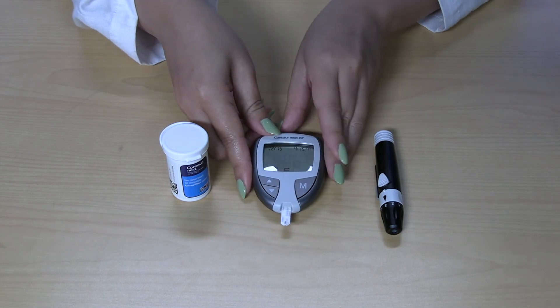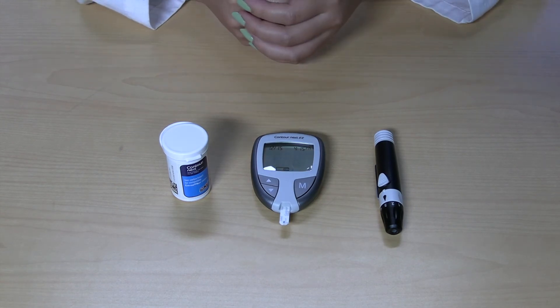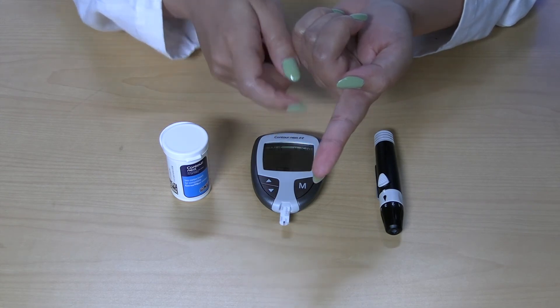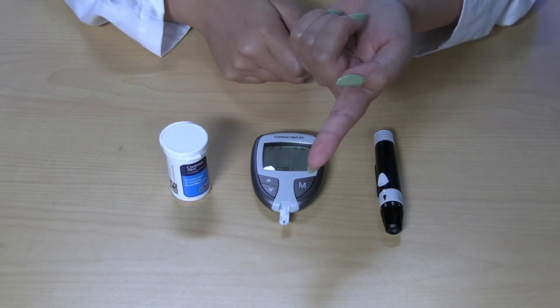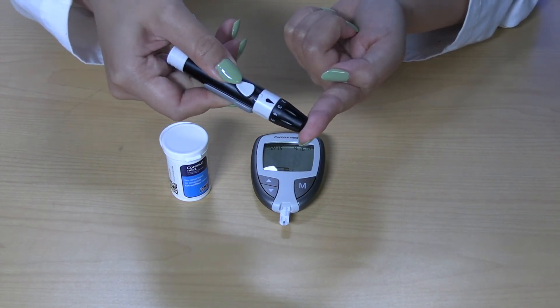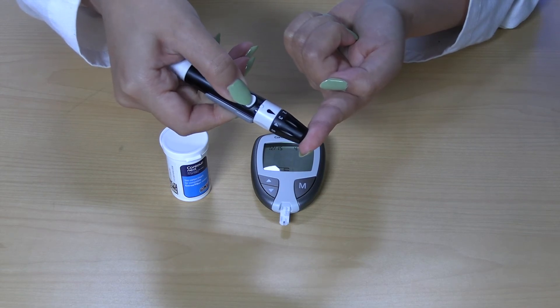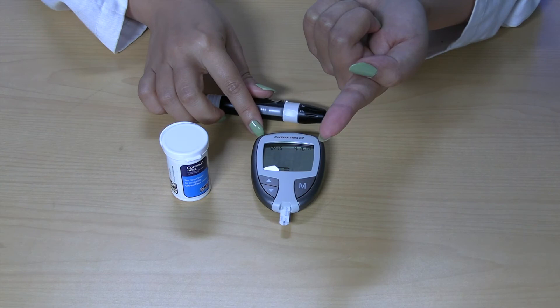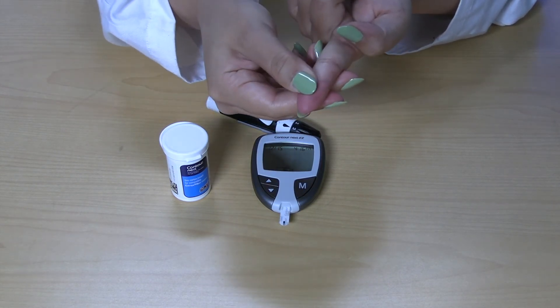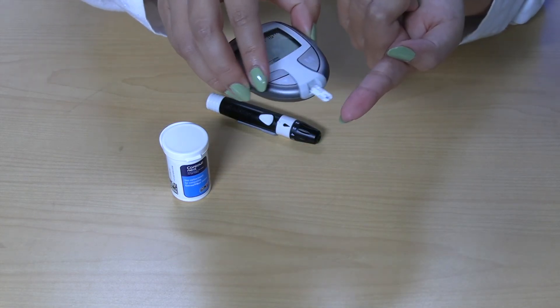You can rub your hands together to make them warmer and get more blood flow to the finger. It is better to use the side of the fingertip because it is less painful than the middle of the finger pad. Pick up your lancet device and push it hard against your fingertip. Press the white button on the device to poke the finger. Massage your finger towards the poked spot to obtain a drop of blood and apply it to the end of the test strip in the meter. It will take about five seconds for the monitor to give you the reading.